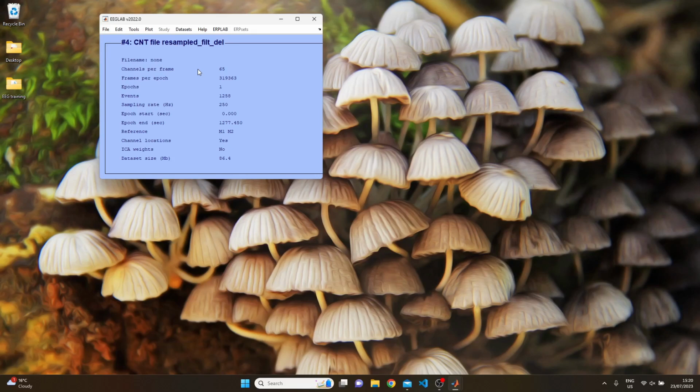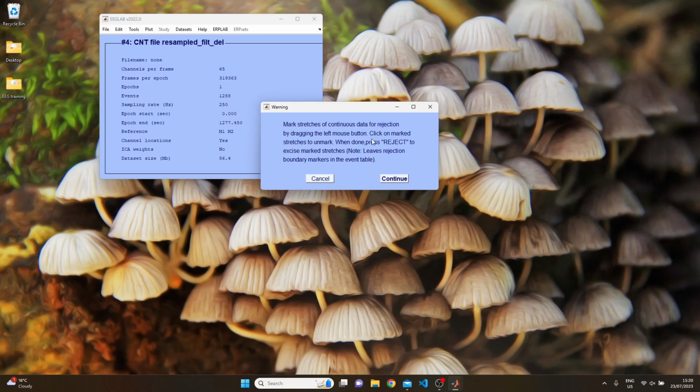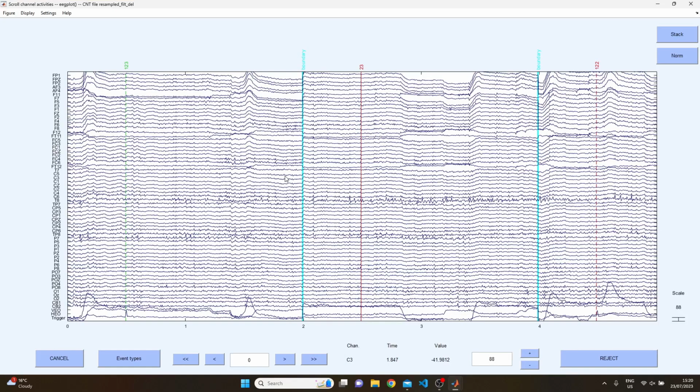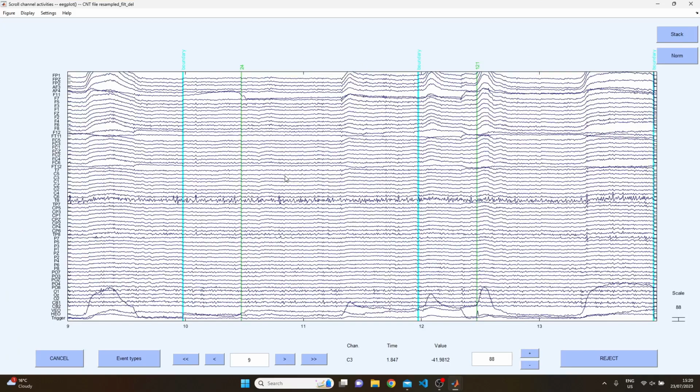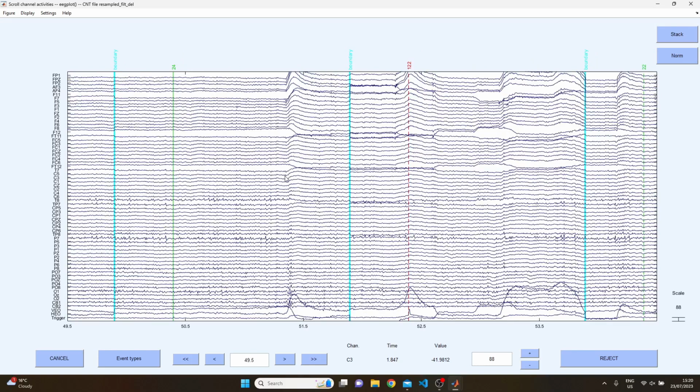You might now want to inspect your data. I suggest this because there might be 1 or 2 crazy events that fall when the triggers do that you also want to remove. Remember that when you do this, you're removing these trials from your dataset permanently, so you really don't want to delete too many. You may also want to look for any blinks that have been cut in half by the data rejection process and remove these.